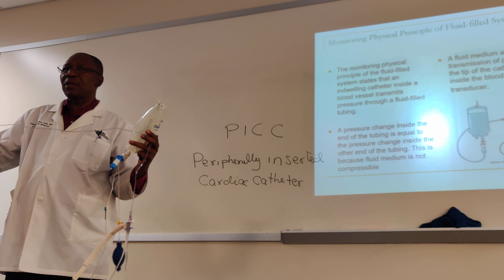So when you have the PICC line, you can use it to administer fluid. You can use it to administer hyperalimentation material like tube feeding. You can use it to draw blood if you need to, okay? So if you have the PICC line, you will also need a fluid filled monitoring system, okay? Then it says that the bedside monitor displays the pressures and waveforms in various components of the heart, and that is true.